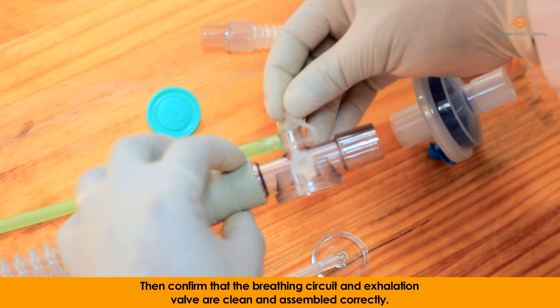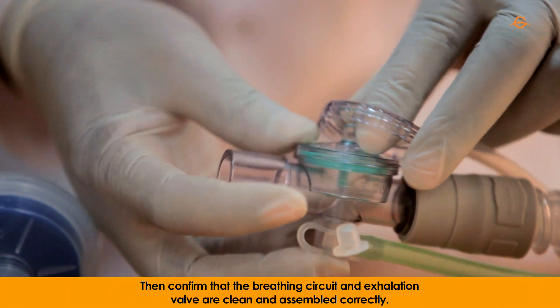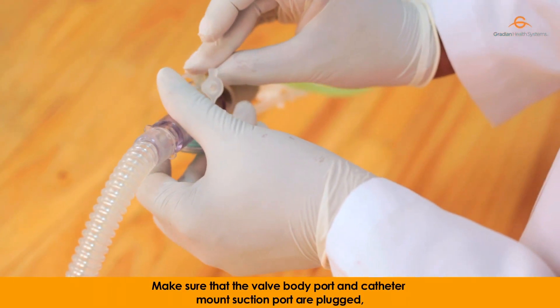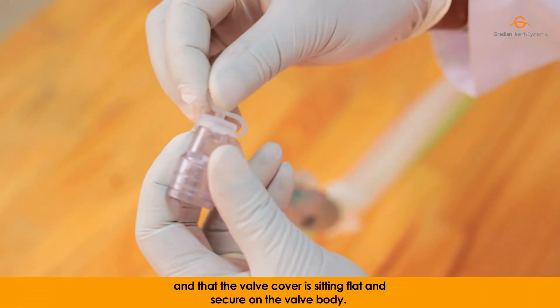Then confirm that the breathing circuit and exhalation valve are clean and assembled correctly. Make sure that the valve body port and the catheter mount suction port are plugged and that the valve cover is sitting flat and secure on the valve body.